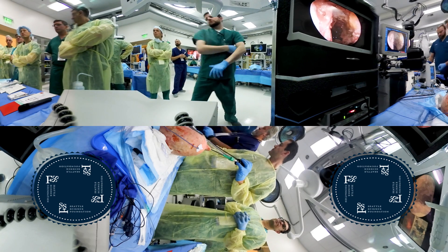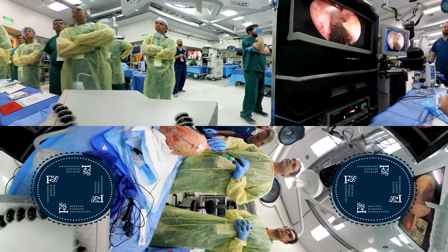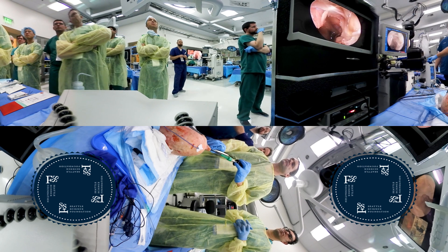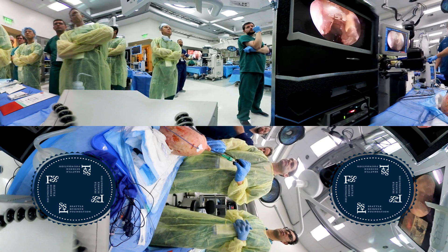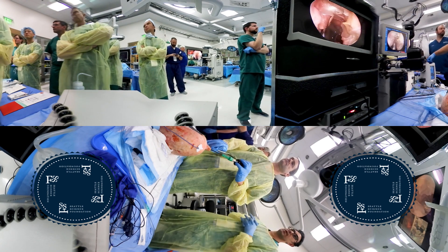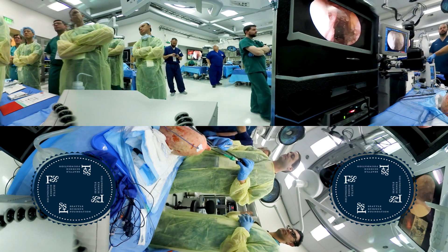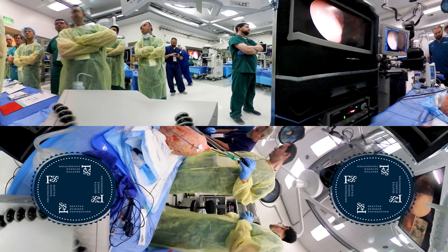I think the most important ingredient when doing thyroid eye disease is that you have to open up the fibrous annulus of Zinn, and to actually get there — as correctly said earlier — there are white fibers just posterior to where you are. In the interest of time we're not doing it here, but if you're doing thyroid eye disease you really have to get your drill out. For thyroid optic neuropathy — not just cosmesis — if you don't deal with the fibrous annulus of Zinn you're not going to decompress at the orbital apex, and that's really where the large majority of the problem lies. Dr. Marty would agree with that as well.